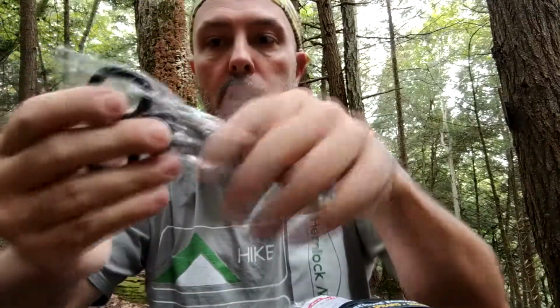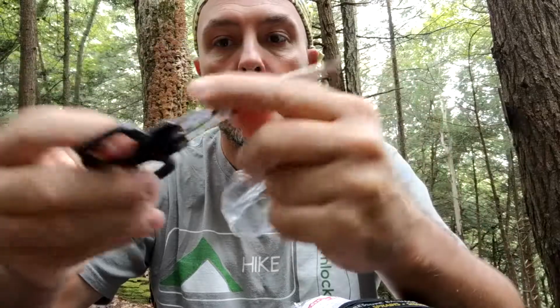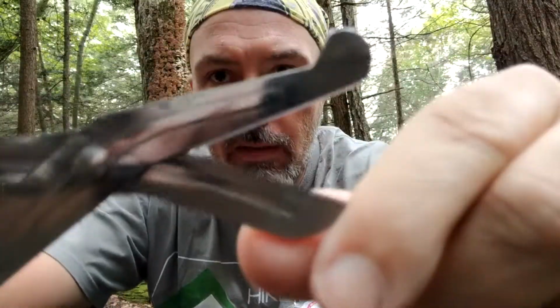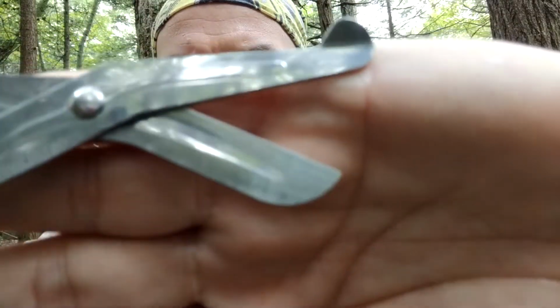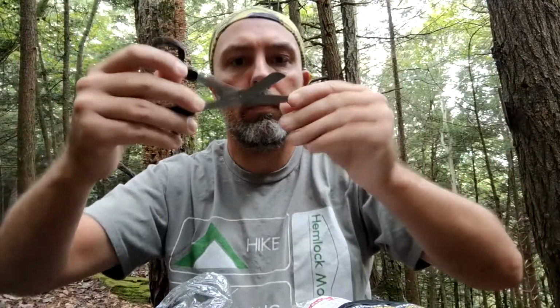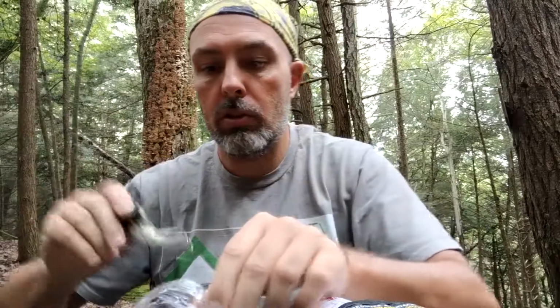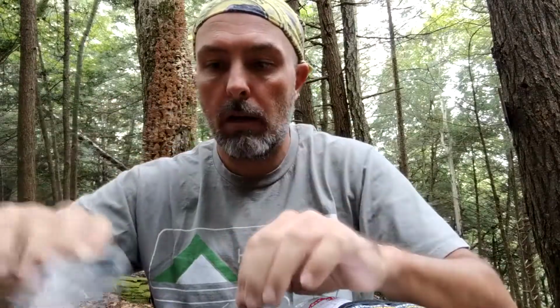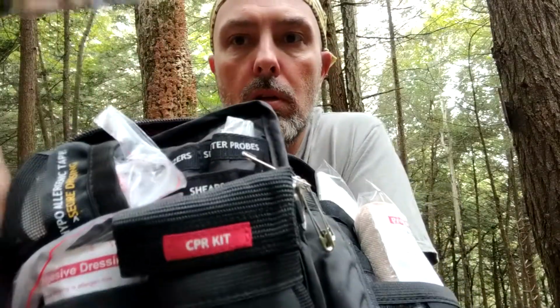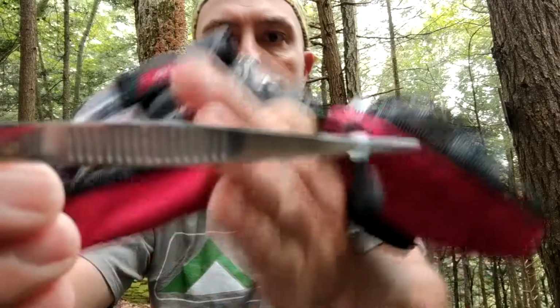You've also got some shears. These are nice for cutting gauze. These are pretty nice. They are serrated. See if you can see that. It doesn't really come through on the video, but a nice little set of shears. There is also, behind that, a set of tweezers right there.